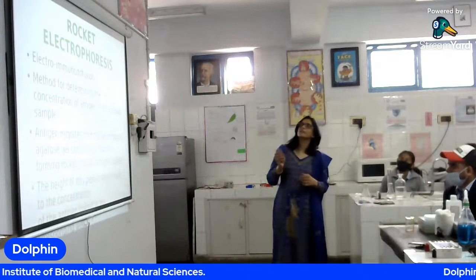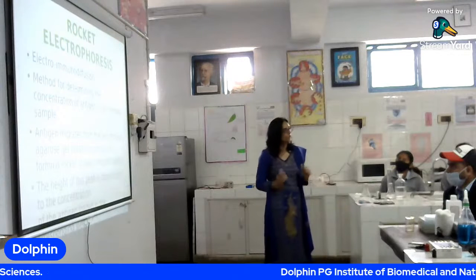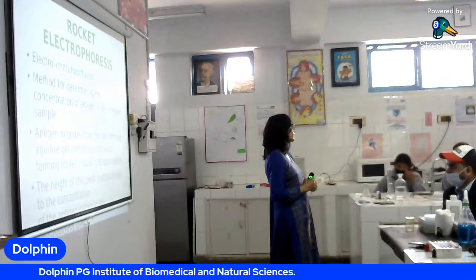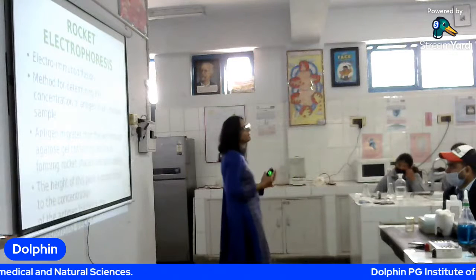So when we are doing this technique, क्यों कर रहे हैं टेक्निक? क्योंकि immunodiffusion तो है ही है, साथ साथ में हमारा इलेक्ट्रिक करंट भी है. तो immunodiffusion से sensitive method हो जाएगा. You may ask कि हमने कल immunodiffusion किया तो simple method था.